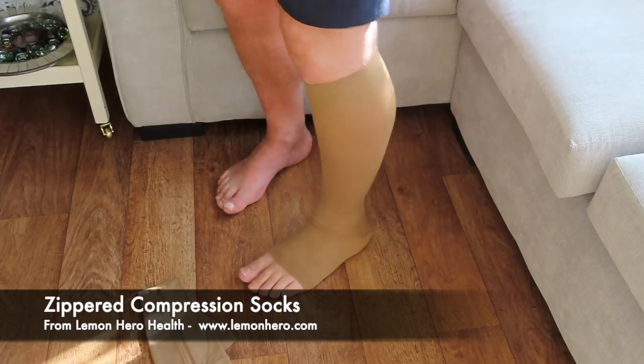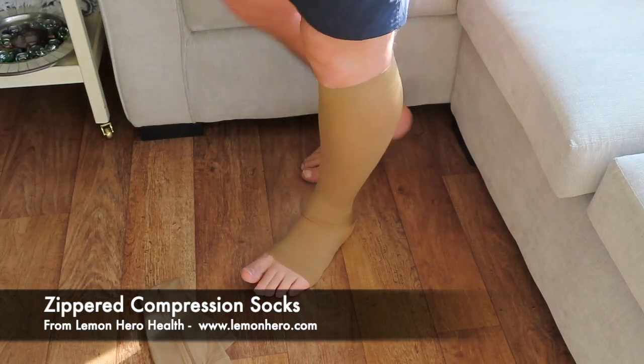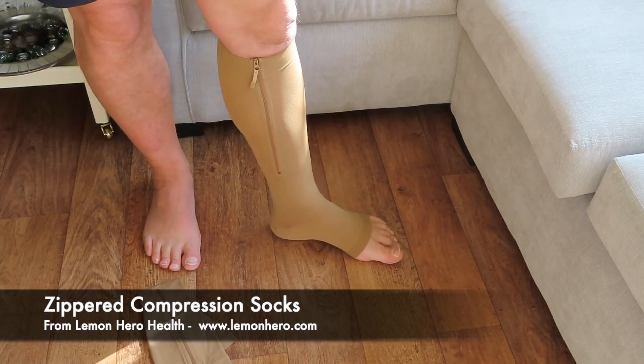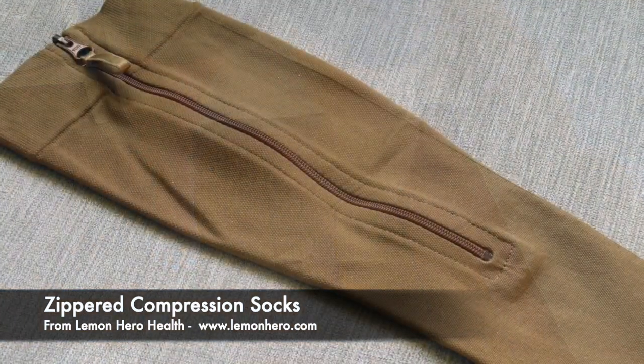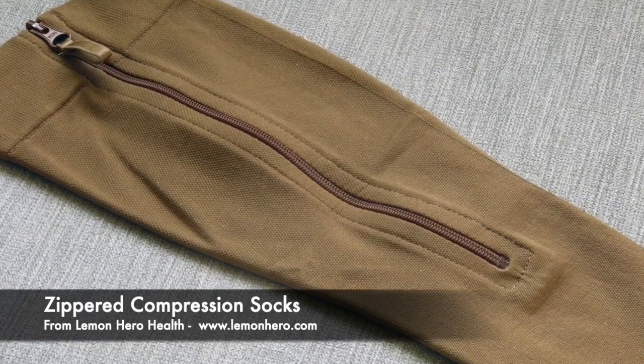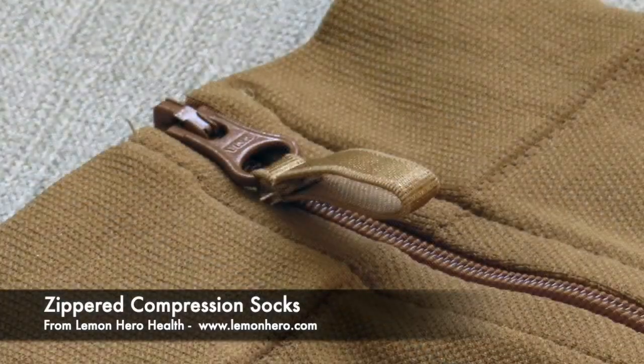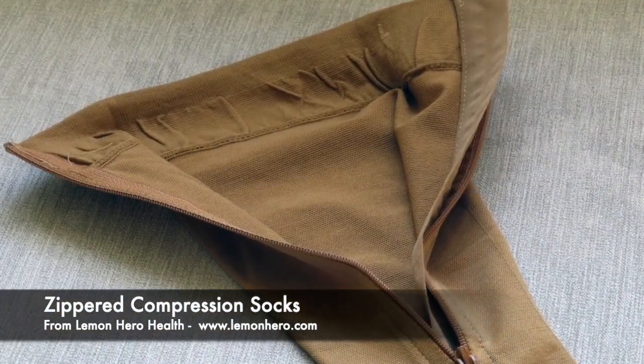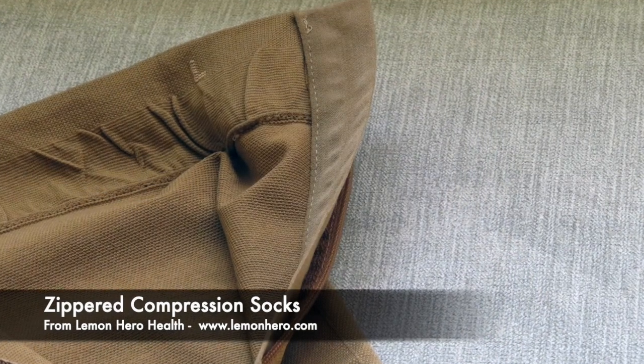That was easy to do and the sock is very comfortable, lightweight, and breathable. As you can see, the sock has a high quality YKK zipper and a tab to make it easier to zip up. Importantly, it also has a flap which protects the skin from the zipper — something most competitors don't have, but which is critical for long-term comfort.